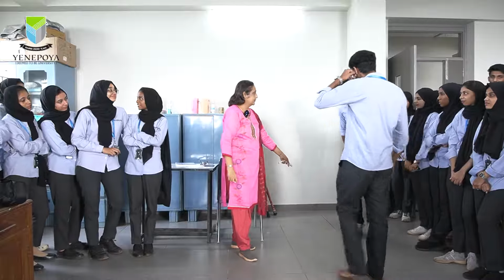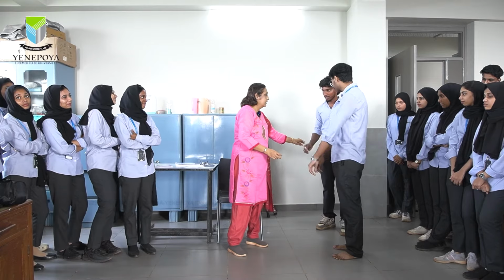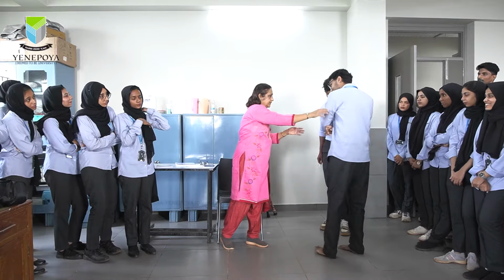Now I want two volunteers who will be measuring and doing a normal gait pattern. Anybody from the boys, please come fast. Take off your shoes, please. Somebody measure it. Okay, come here. You will measure, okay. Take this.